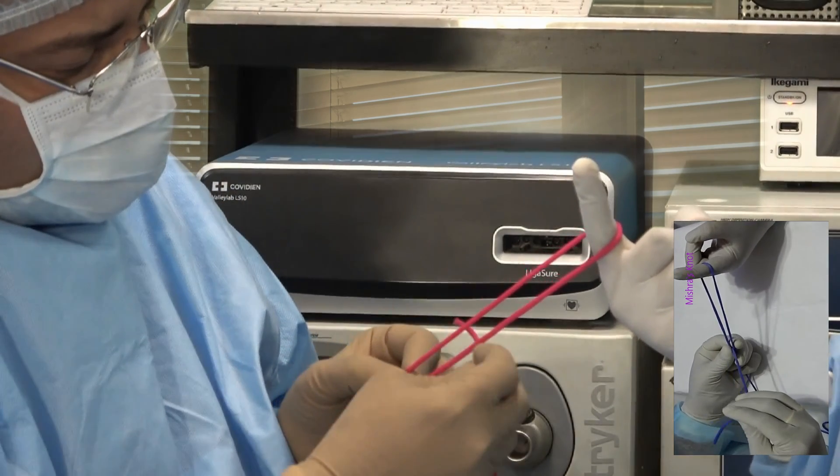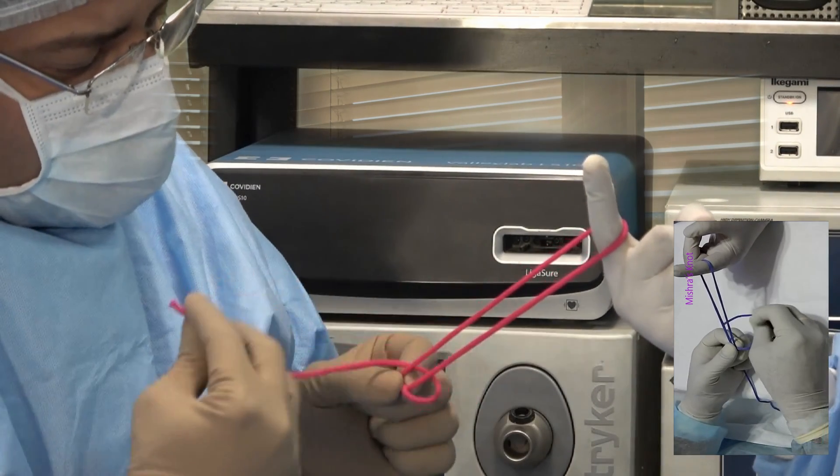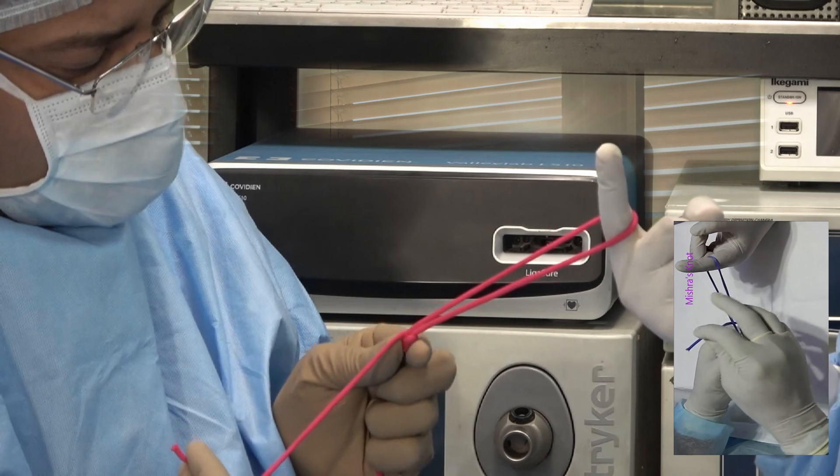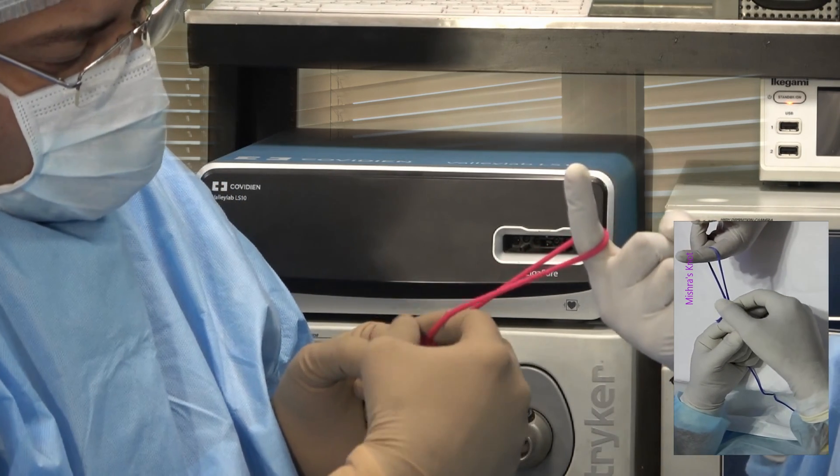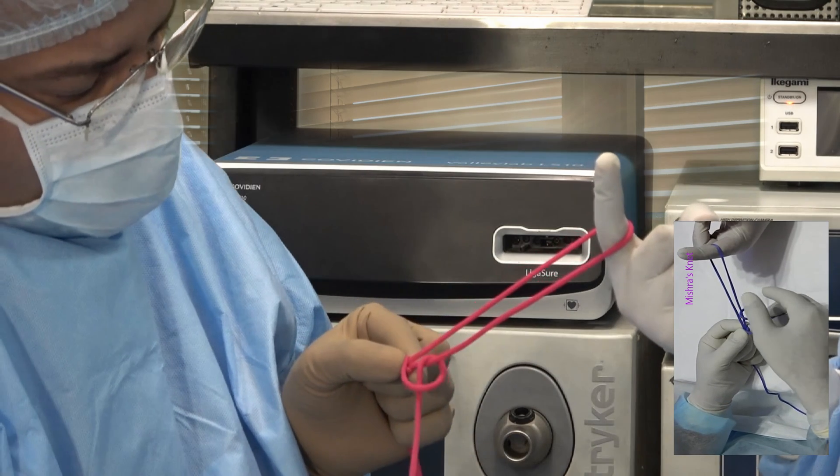And after that, you will take one wind. After taking one wind, you will lock it. You will take a half knot on the right side and this is locked.